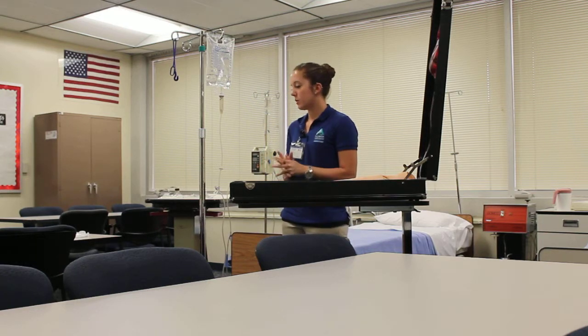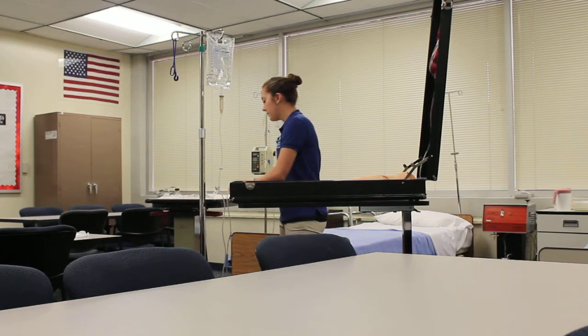At this point, I can take all of my materials as well as the doctor's orders into the patient's room. I would knock on the door, introduce myself, identify the patient using 2 forms, their name and their birth date, and check it against their armband, as well as have them repeat it back to me. I am going to perform hand hygiene and put on my gloves.